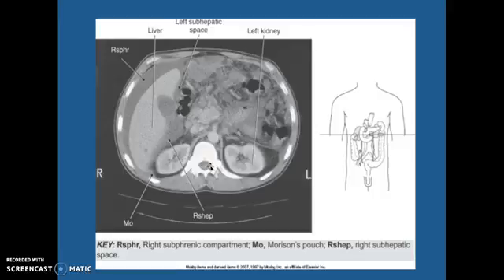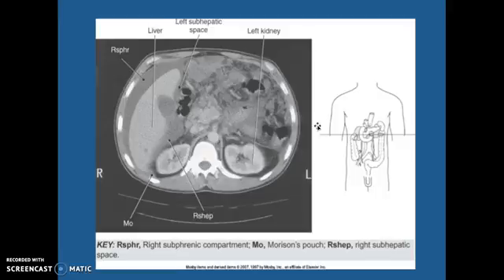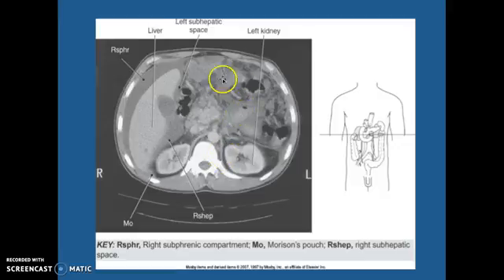This patient here — this is a CT post-contrast — this is what we call stranding. You can see all those little lines everywhere. That is inflammation. If you look at a normal scan, it doesn't have all these little gray lines. Those little gray lines mean that this patient has some kind of inflammatory process going on, typically a bowel perforation. Here's the liver and here's the gallbladder. We're looking at the left kidney here, right kidney. Here's your aorta, your right crus, your left crus, and then all of this is bowel, but it's hard to differentiate the bowel because of all the inflammation.